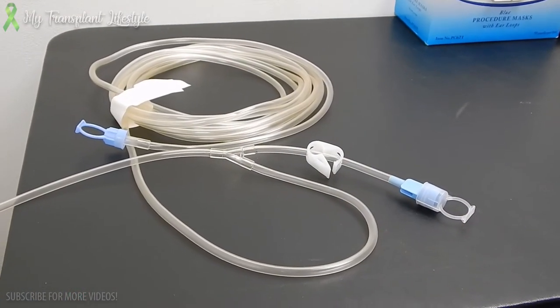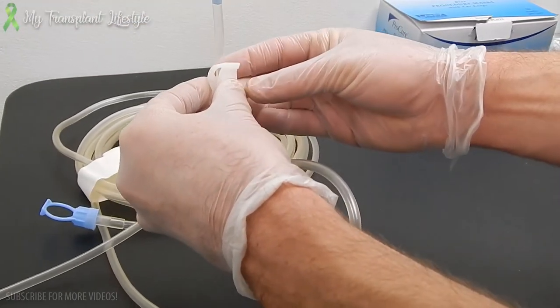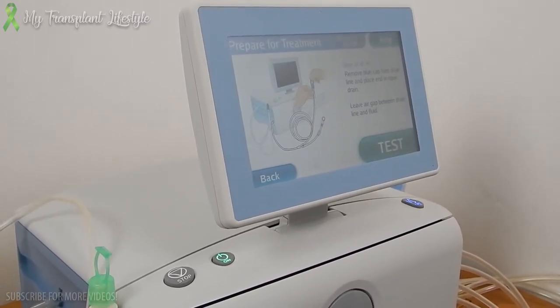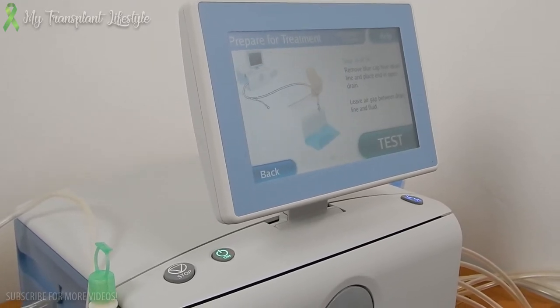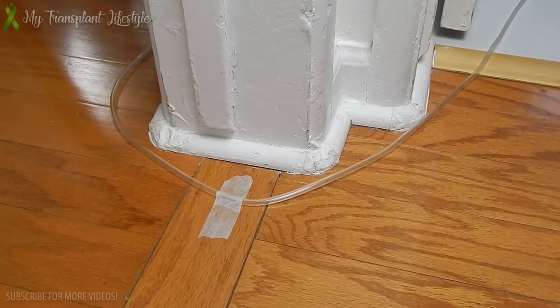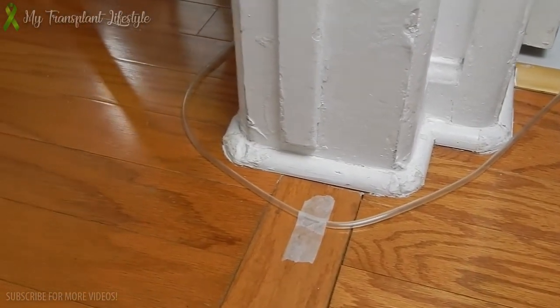Next step is working with the drain line. Clamp the Y connector. Remove blue cap from drain line and place end in open drain. Leave an air gap between the drain line and fluid. The next step is setting up the drain line. For us, ours is hooked up into our restroom. Here is a sample of how we set up our drain line in our bathtub. We also secure the line with tape leading towards the bathroom, just in case anyone steps or trips on it.